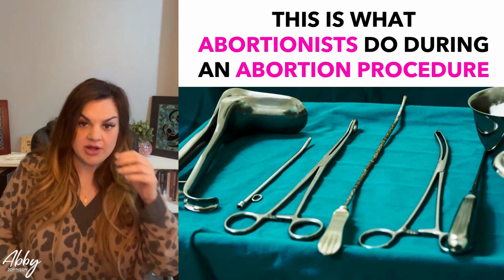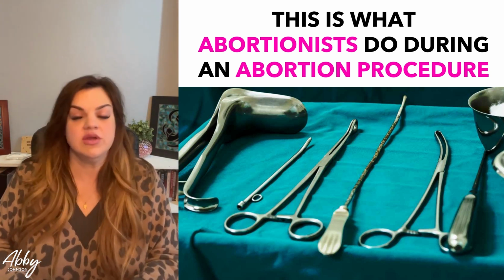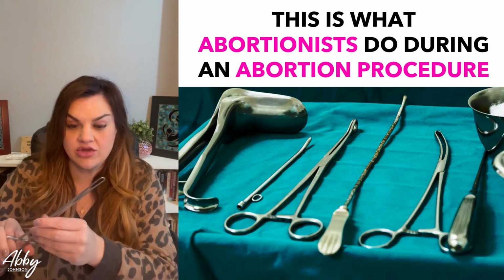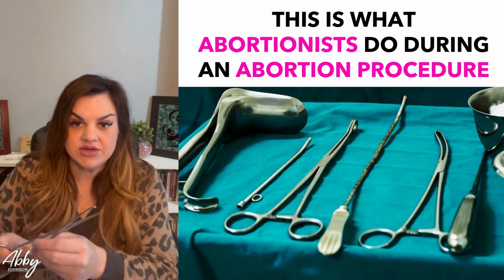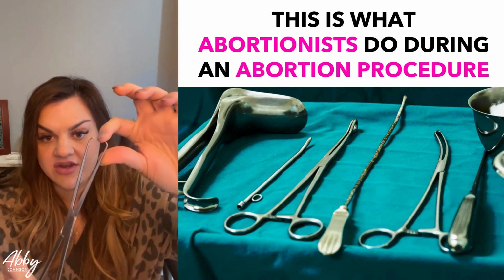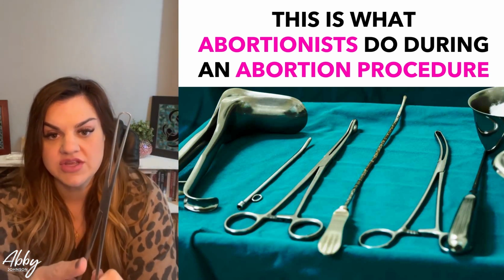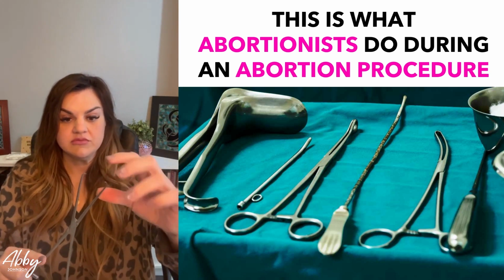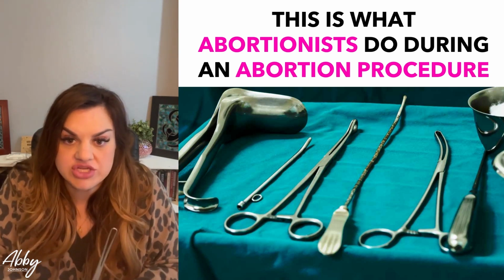So they get a woman on the table, and one of the first things they're going to do is they're going to clamp this instrument. It's called a tenaculum. They're going to clamp this on her cervix. And this is going to help them stabilize her cervix during the actual abortion procedure. Now, if you look here, you can see that this is very, very pointy. So these are very, very sharp teeth. This goes through the skin. So this goes through the cervix as they are getting her prepared to actually insert metal dilation rods.